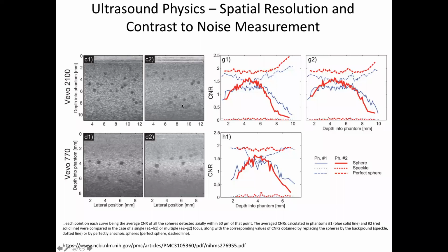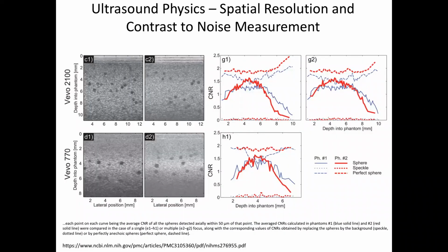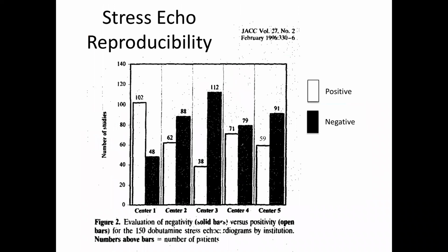So that's how you would do it for any transducer that you've got in your hand. You would make some phantom, put echogenic stuff in it, and measure these curves to optimize. Okay, I think we already looked at that.